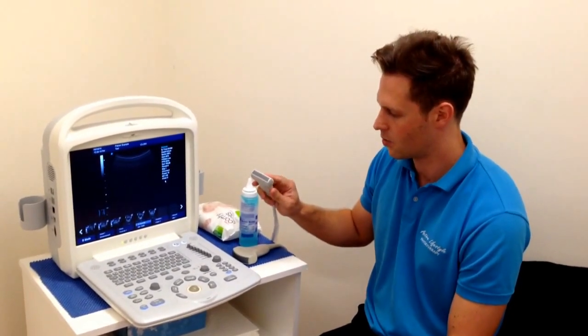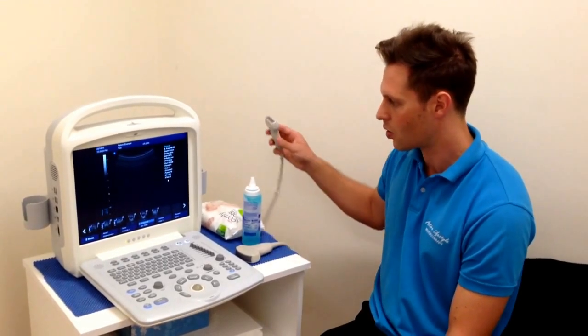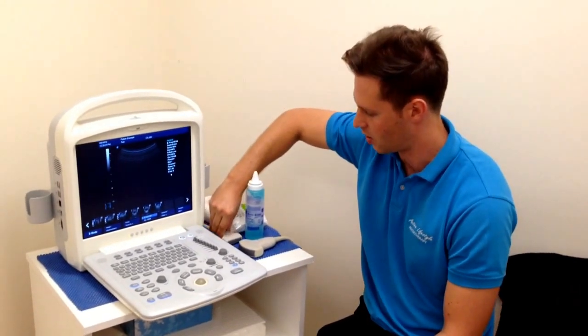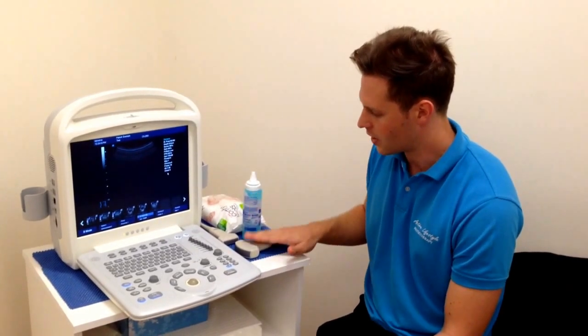The higher frequency allows us to get really good definition of more superficial structures like tendons, the shoulder, small muscle parts, and nerves. So depending on what you're using it for in a physiotherapy context, often we need to have both probes to be able to visualise all the structures.